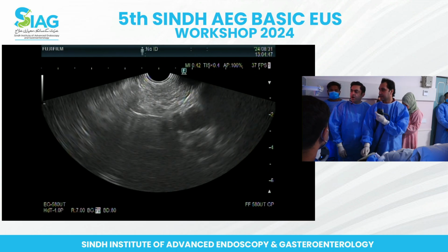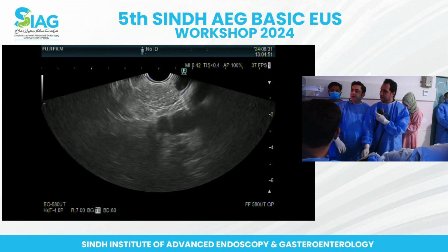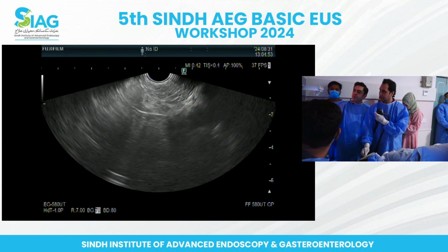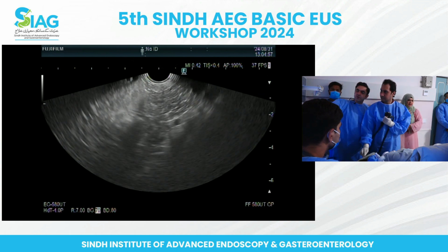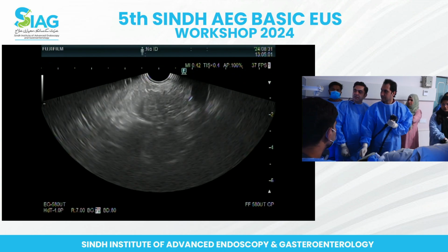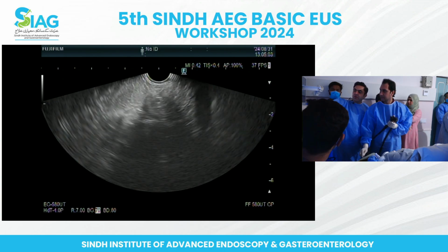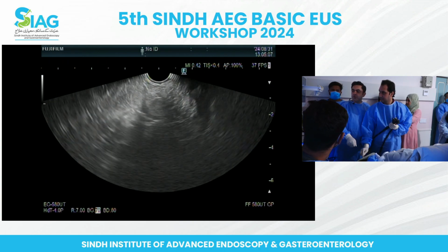We're counting the PD. So yeah, that's probably the PD. We can see the PD. Yeah. So keep on going. If you move in an anti-clockwise way, you are going towards the head. Can you see the PD? It's now disappearing a bit. Yeah. Excellent. So that's the fall off of the portal splenic. Yeah. And now you move towards the clockwise.